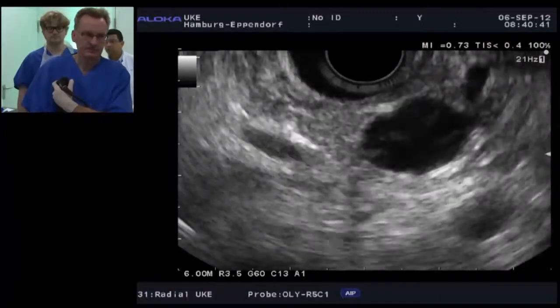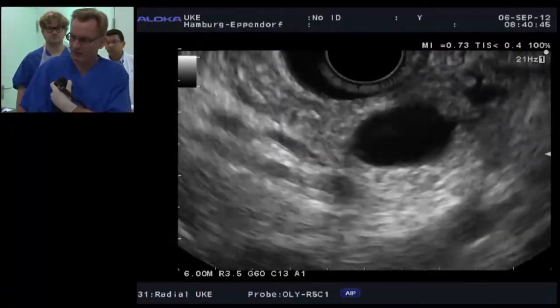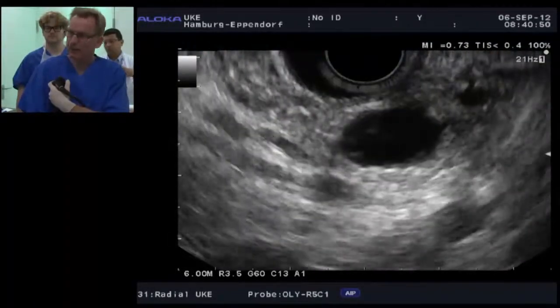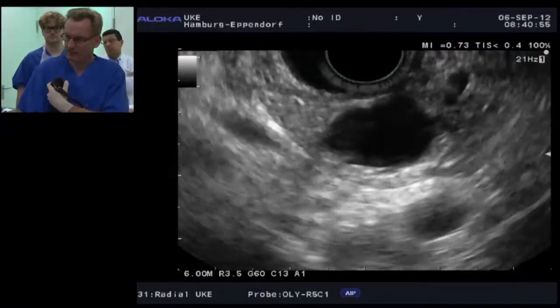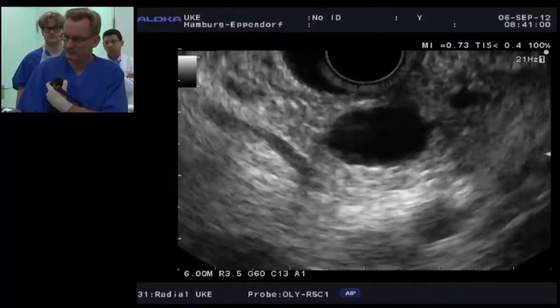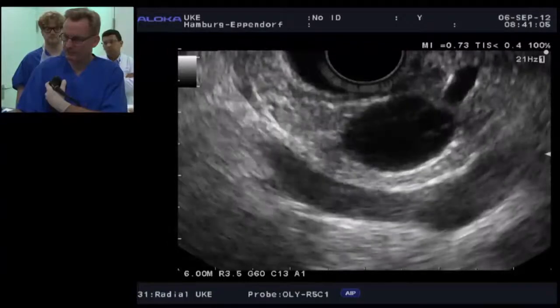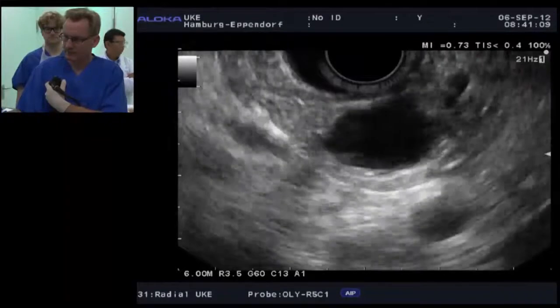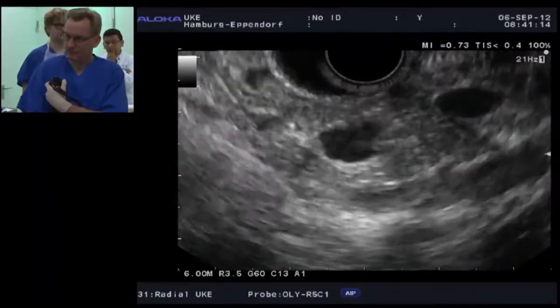That's a very good point, because it's not uncommon that you see a slightly dilated main duct in this setting, and that's a critical difference, because main duct IPMN is operated on and side branch is usually not operated on. Yes. In the Tanaka consensus guidelines, the definition of main duct dilation is 6 millimeters. So even though technically this duct is dilated at 3.8 millimeters, normal should be 3 or less. Yes. It doesn't meet the Tanaka guideline criteria of 6 millimeters. So I would agree we would not classify this as main duct IPMN according to those guidelines.